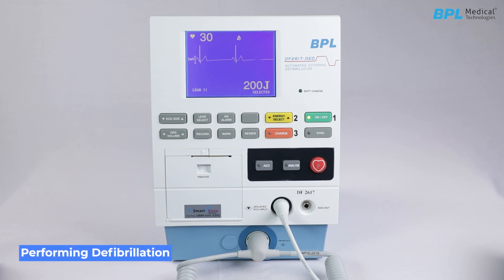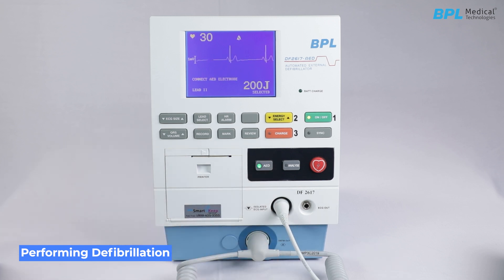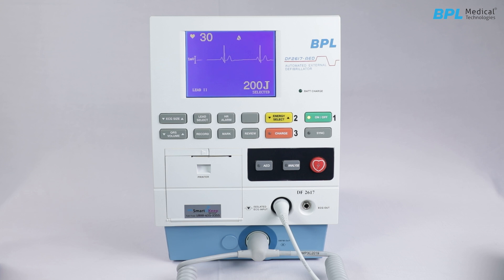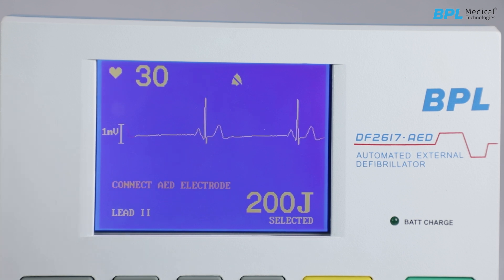Performing defibrillation in AED mode: Switch on the AED by pressing the AED ON/OFF key. The user is guided step by step with the aid of display messages and voice commands. Visual indications in the form of LEDs are also provided on the front panel. These LEDs light up at different stages of the AED process. If an external paddle is still connected when AED is switched on, a warning message will display on the screen.